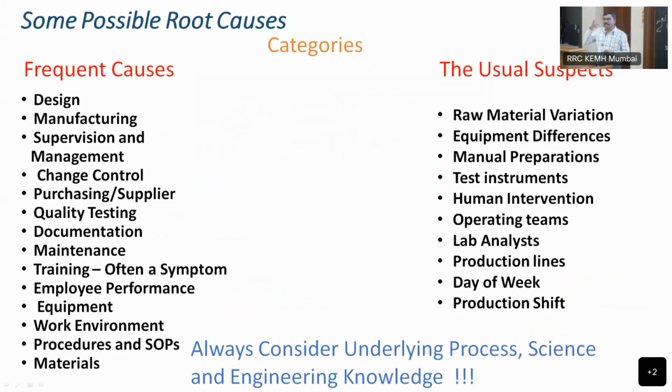Design. Sir gave an example, movement of a sample within the lab. So we have to arrange our equipments for the automated analyzer in such a way that there should not be a haphazard movement of the sample. One single sample being shared on multiple platforms also. So you have to work on the design actually. The root cause is design is not proper.